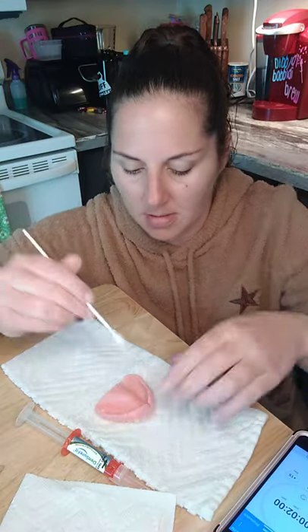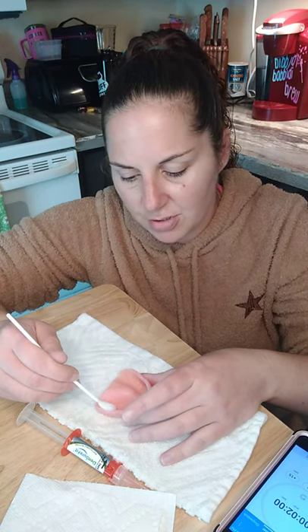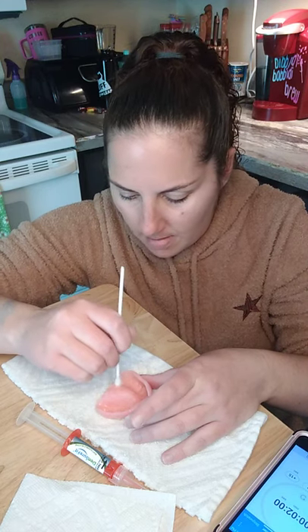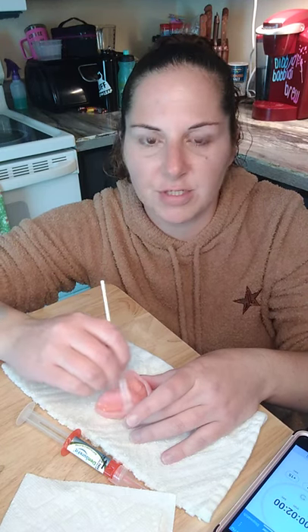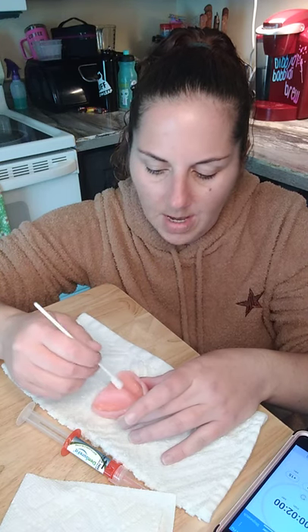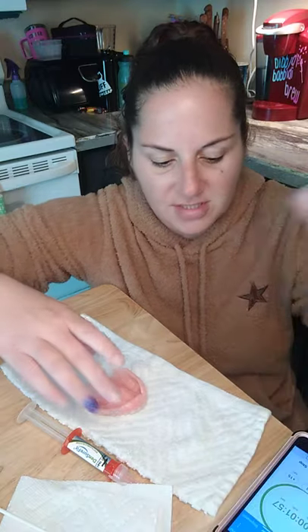Oh, I got a little bit on my skin. I'm getting a little too excited. But be careful. Go all around. Make sure you get everything, because this primer is what helps it seal. And make sure you have a timer ready to go for 2 minutes, because once you're done applying it and every spot is coated, you never know. You can always miss a crack or crevice, guys. You can always miss something, and I do not want to miss anything. So just coat. Okay, I'm all coated and ready to go. I'm going to press my timer. While I'm talking to you guys, I'm letting my timer go.